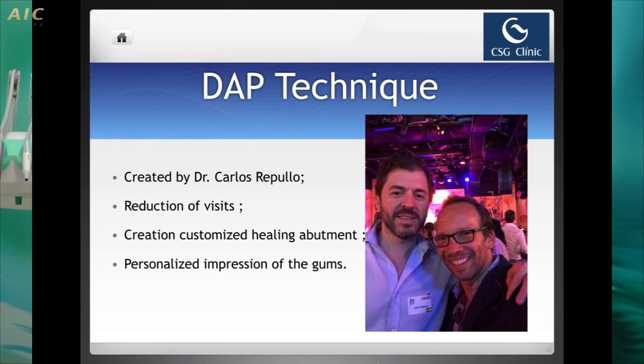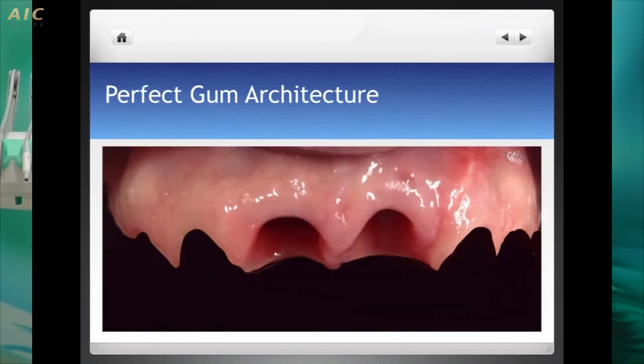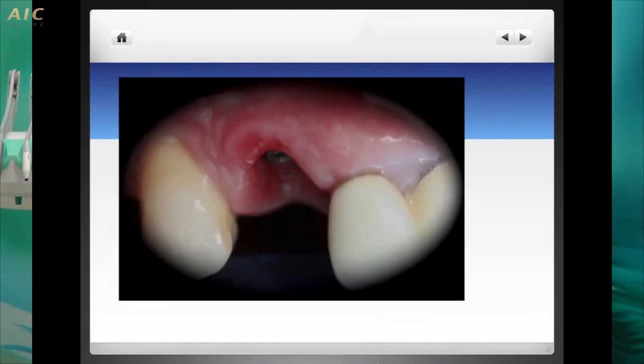So he had a lot of answers for me, and with that technique that he created, you can reduce the number of appointments, and create a customized healing abutment, which was fantastic. And I learned a lot from Carlos Repullo and that technique. Okay, so we dentists, what do we want to create? Perfect gum architecture. All of us want to create something like this.